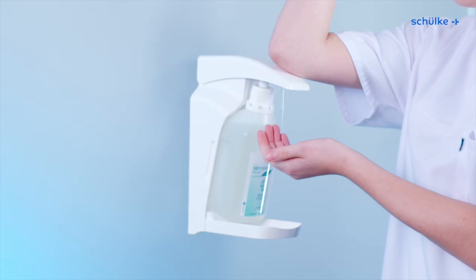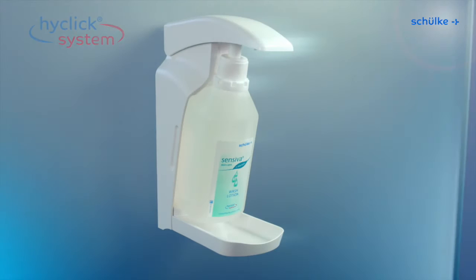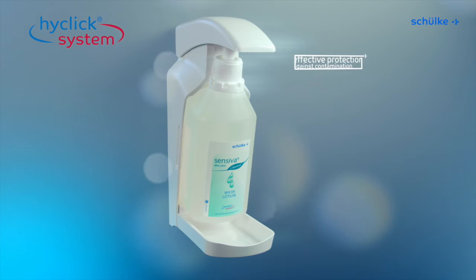And germs have no chance. With this system, the risk of contamination is eliminated. The new HiClick dispenser system from Schulke — effective protection against contamination.